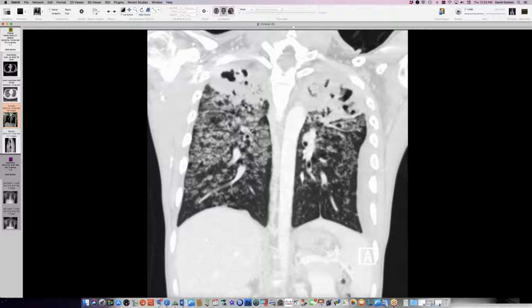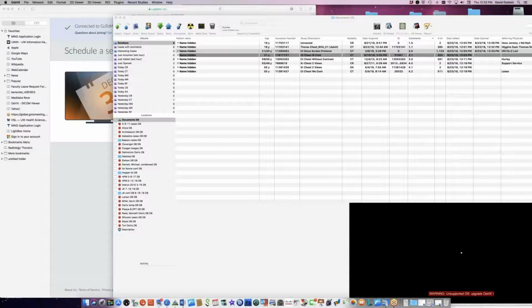I think that this may be a matter of the extent of disease. I think if earlier one had imaged that, in every one of those areas of rosettes, the bronchioles would have been opacified. But as the material left the bronchioles into the peribronchiolar alveoli, those portions of the pulmonary lobule became more opacified. So you're left with this pattern. Because I think in between some of the larger areas, I can see bronchioles. Right. And a little bit of tree in bud. I think this is just a matter of how florid the abnormality is. Yeah. So tree in bud going on to flower completely. Yeah. Impressive. Right. Okay.